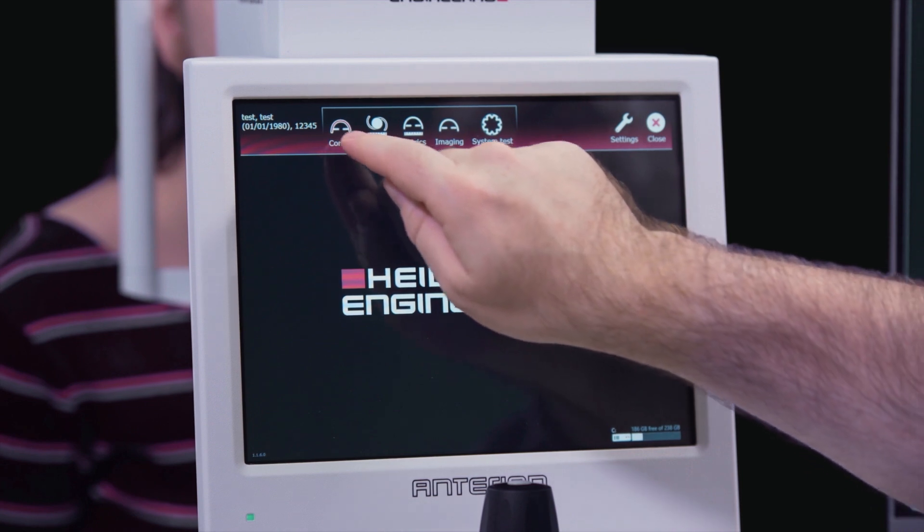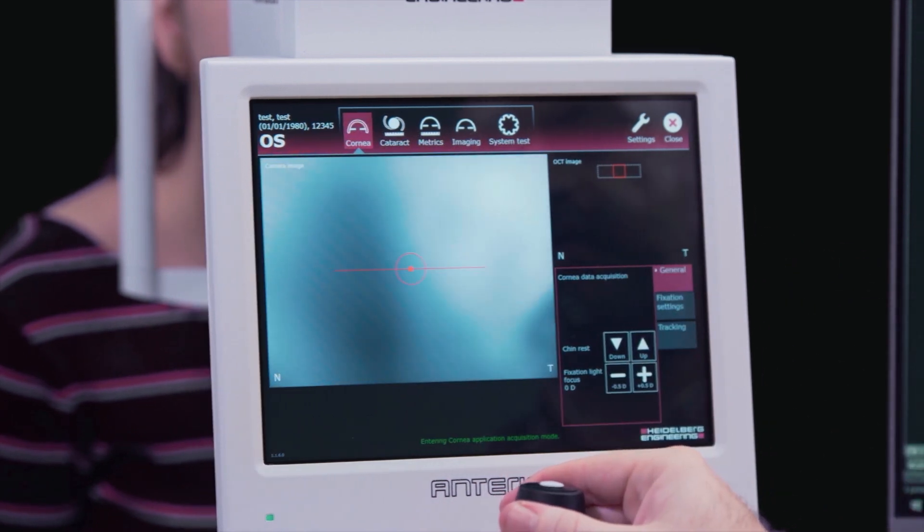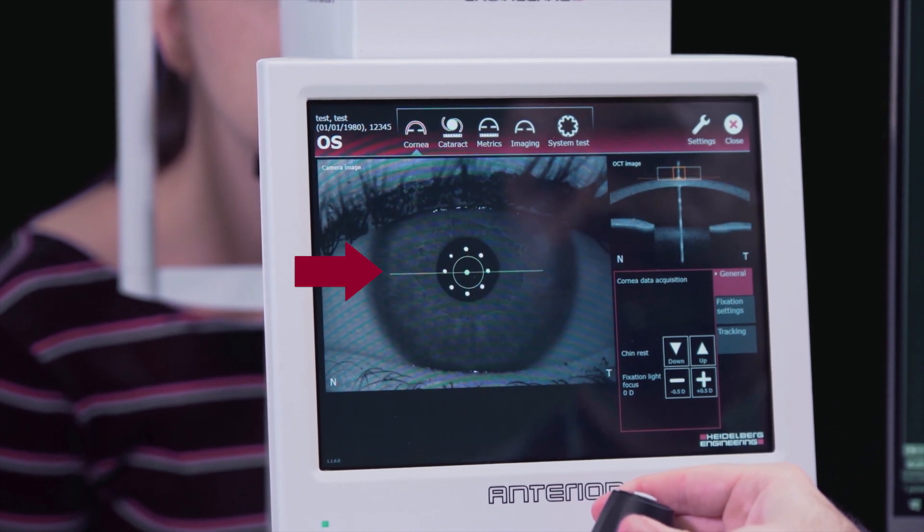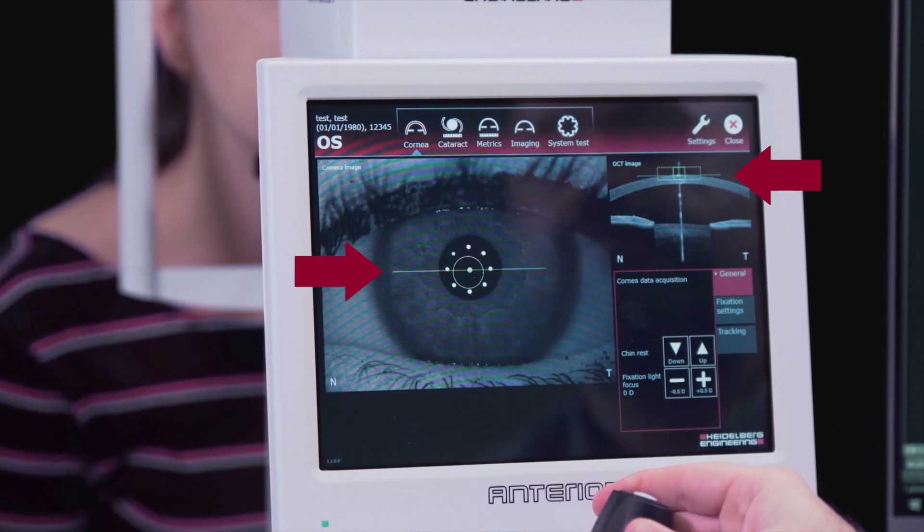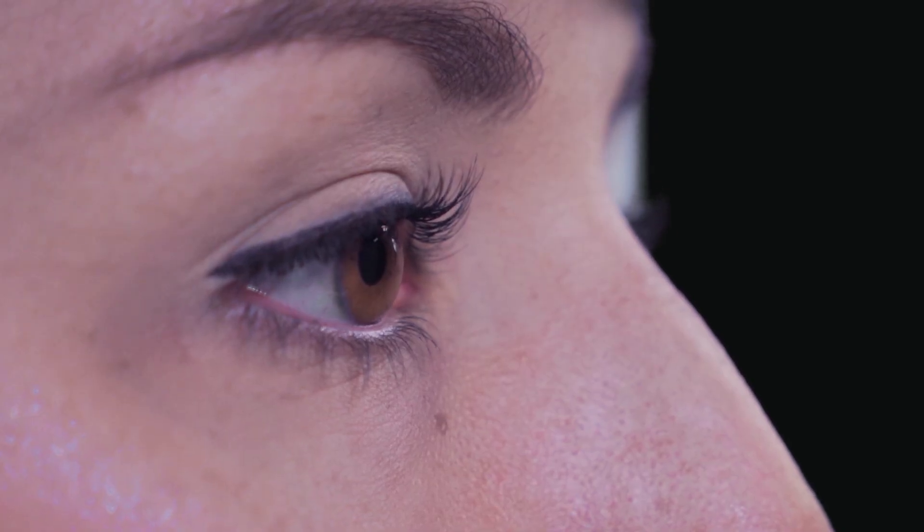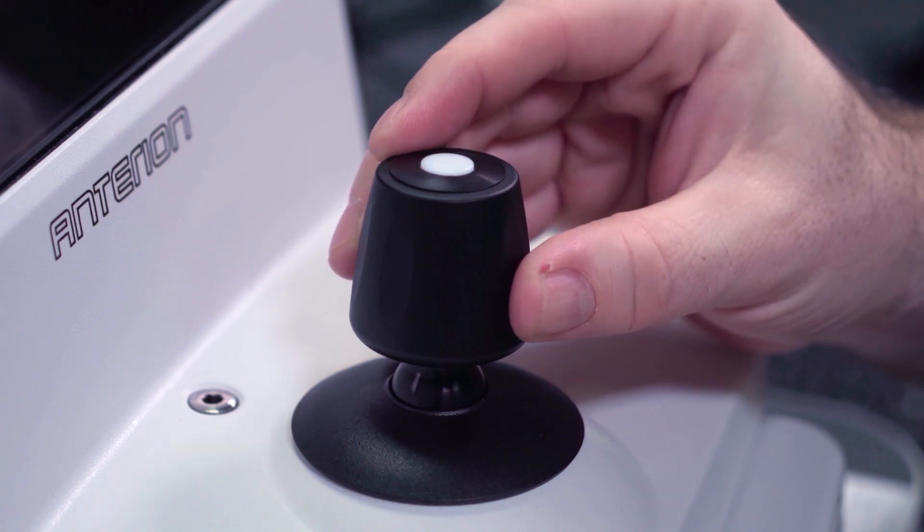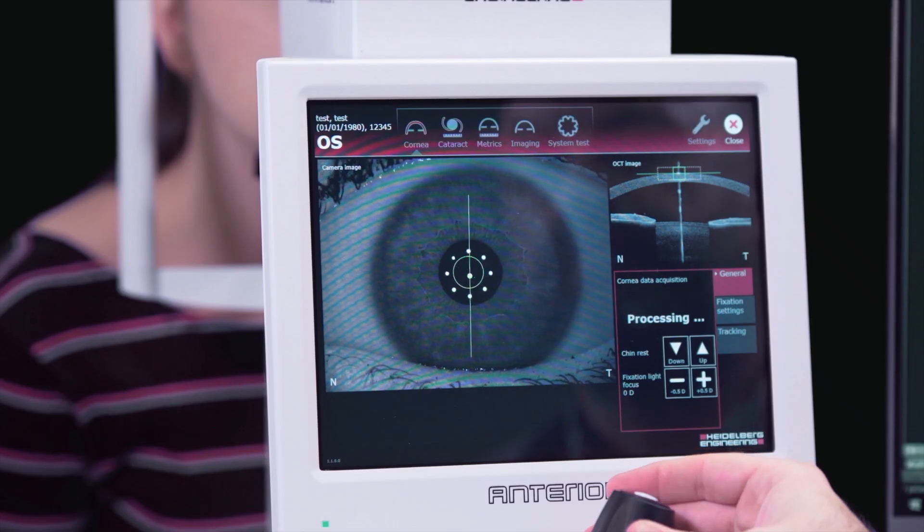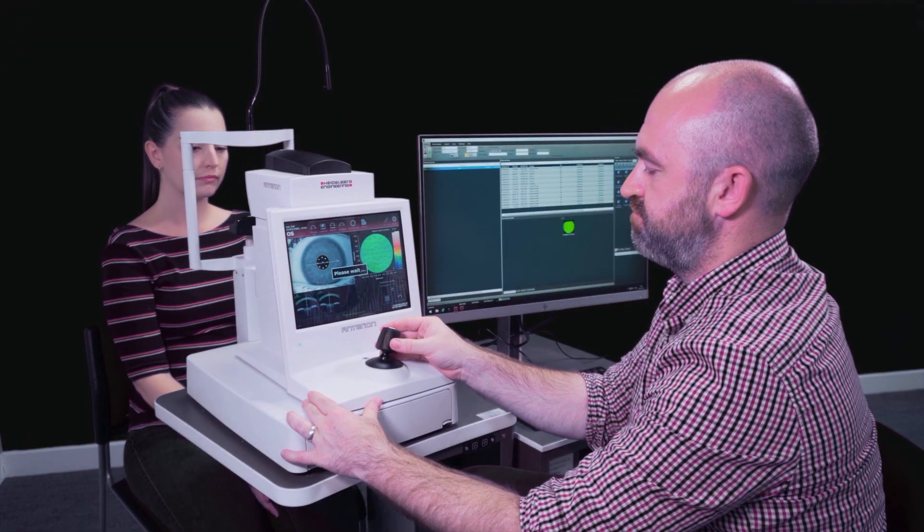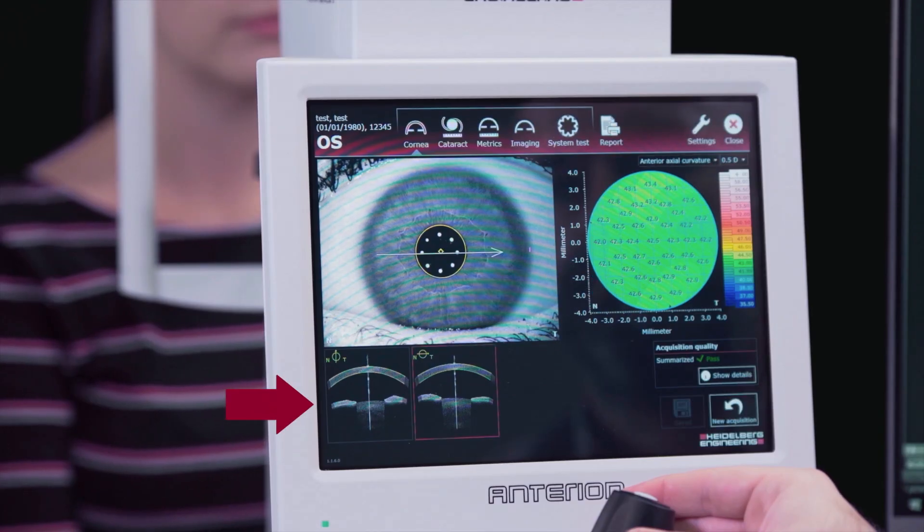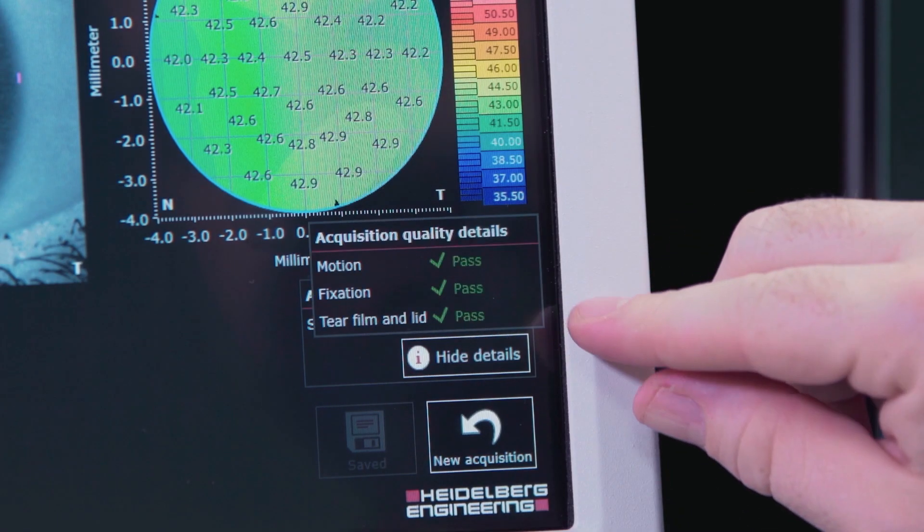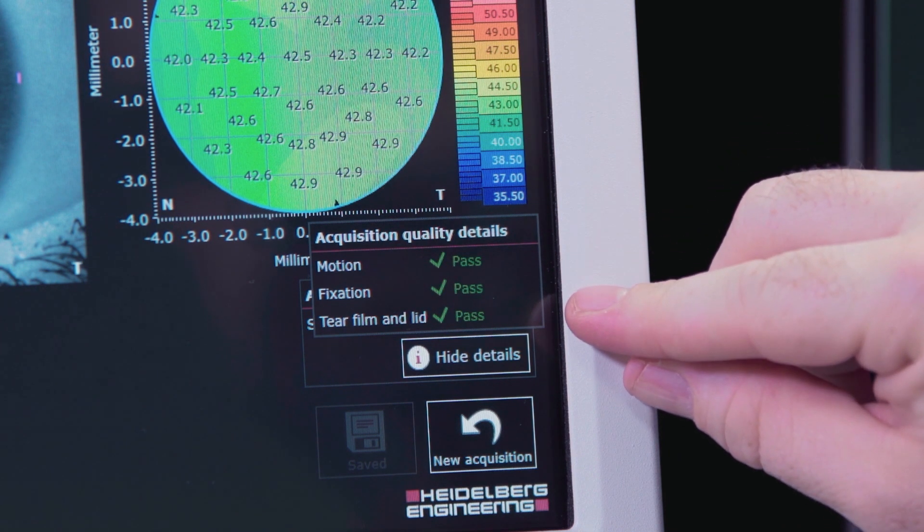Press the cornea app on the touch screen. Align the patient's eye in the camera image and OCT image window until the horizontal lines turn green. Ask the patient to blink and open wide before pressing the joystick button to acquire the image. Check the OCT corneal boundaries are adequately segmented before checking the acquisition quality summary, and repeat if required.